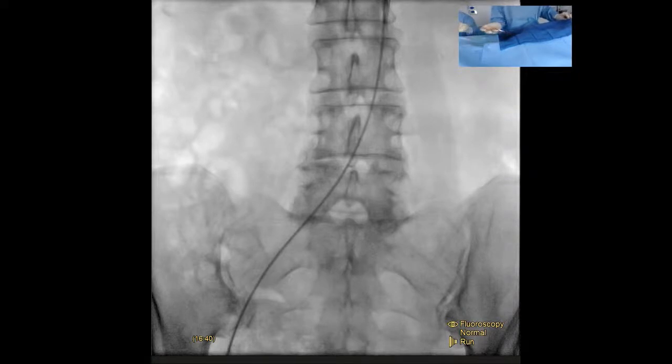To come in as a patient and have a case like this, where all you're doing is getting a single puncture in your groin area, and all you're feeling really is the lidocaine sting, and then to have your hemorrhoids treated 40 minutes later without feeling pain during the procedure, no bowel pressure, is pretty remarkable. Yeah, it's really unbelievable. I think this procedure has really come a long way, with such high success rates, now published over 90% consistently, compared with other therapies like banding with success rates that are probably 20% lower, or may require multiple treatments. It definitely has become very desirable for our patients.